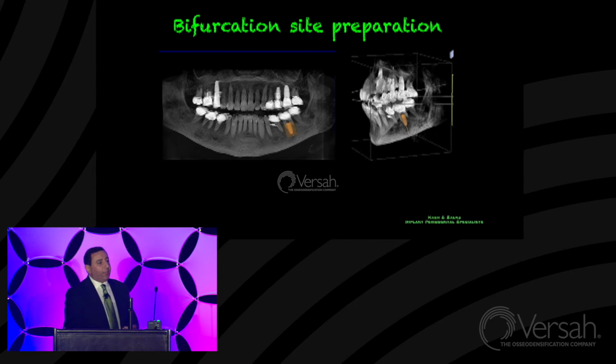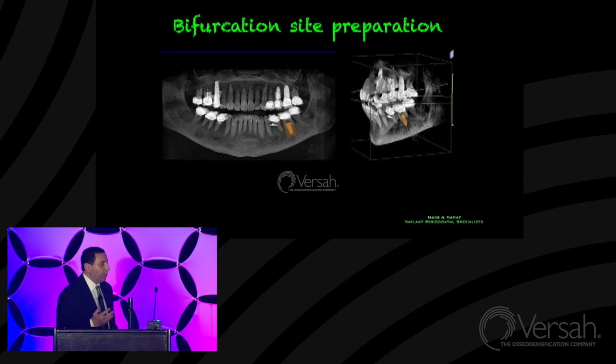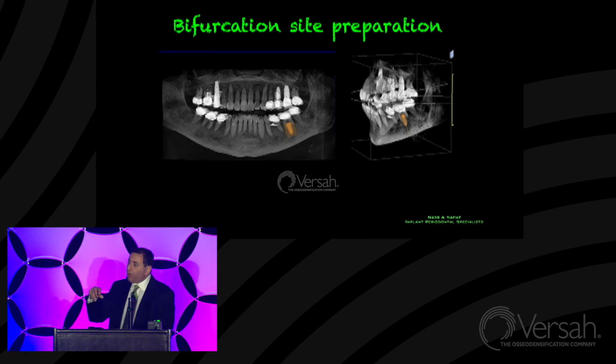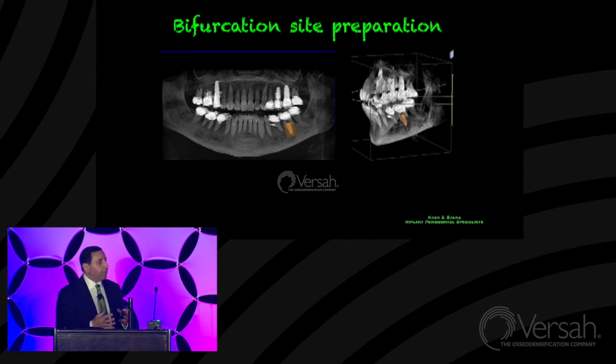So when I take a look at this, most of the time in the past when I did an immediate molar extraction, I had a problem with getting my initial drill to engage the bone. So we didn't have anything like precision drills 25 years ago. When precision drills came out, we used those. When Lindemann drills came out, we used those. And when some of the Koreans introduced to us the drills that would core out the bone came out, we found that would be an easiest way to get something to engage in order to place the implant in the proper position.